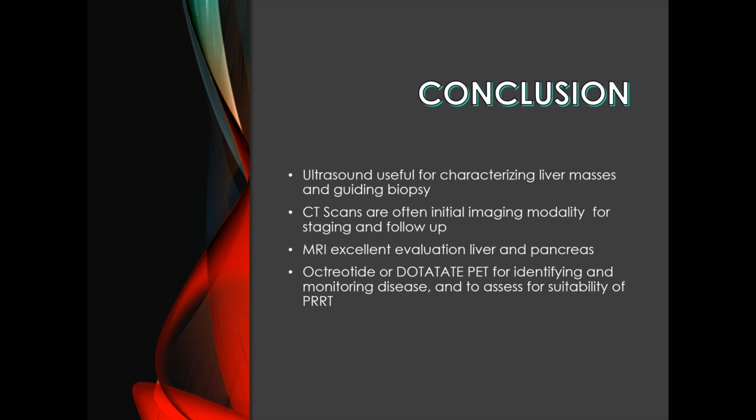But when you first have a CT and they don't know what the issue is, maybe just generalized abdominal pain, they probably will give you a bit of what's called oral contrast to drink, so that we can see where the bowel is and separate that from other structures. But if you're doing CTs a lot, then eventually we don't need that as much, and so we might just skip it now.